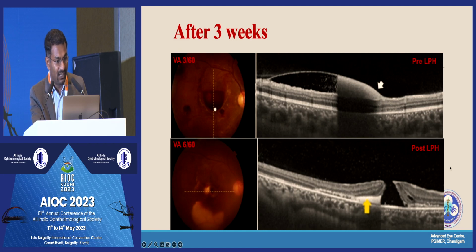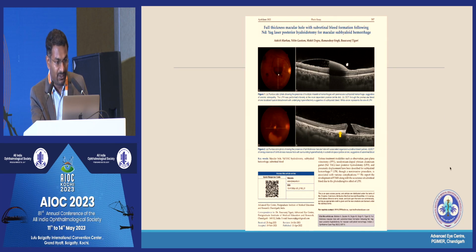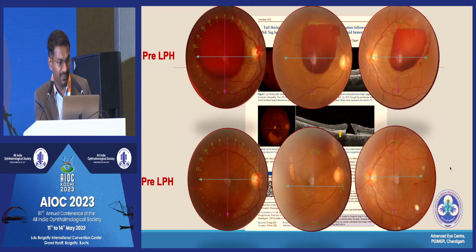This is a known complication whenever we use higher energy or exactly hit the fovea with the laser; these complications are notorious to happen. We published this case in IJO. After learning from this mistake, we have performed about 9 cases.